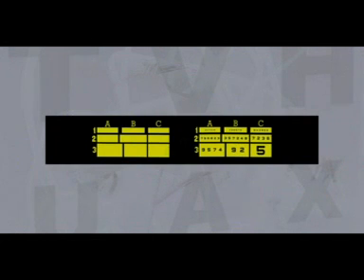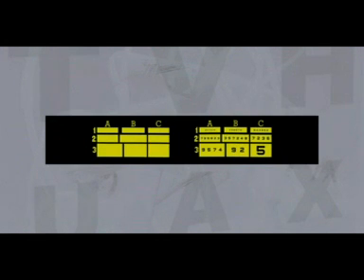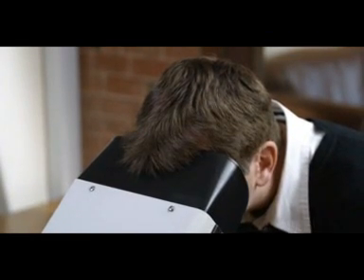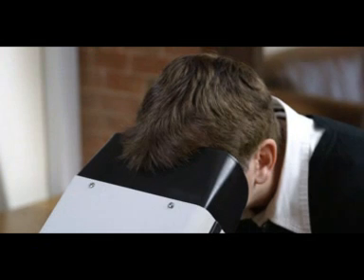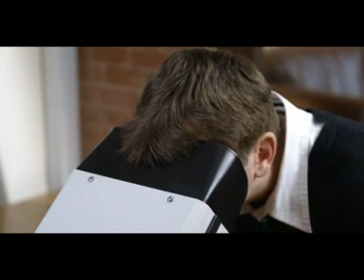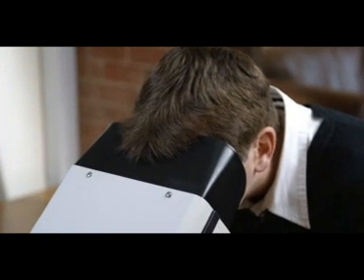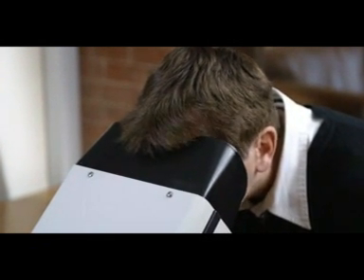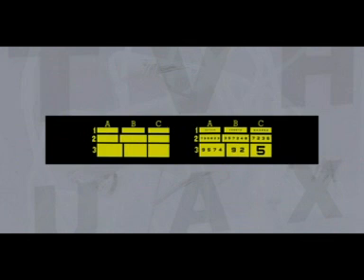One mistake is allowed for blocks A1, B1, C1 and A2, as indicated on the record form. Can you continue and read the next block, please? That's 1B. Four, two, eight, five, seven, eight.